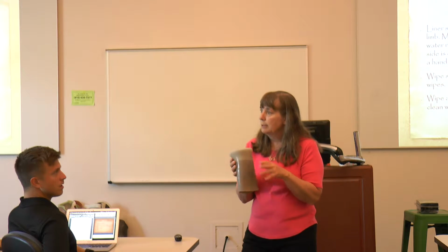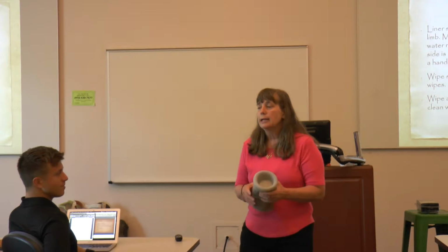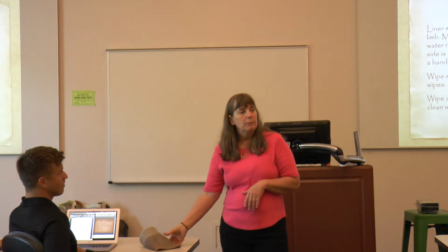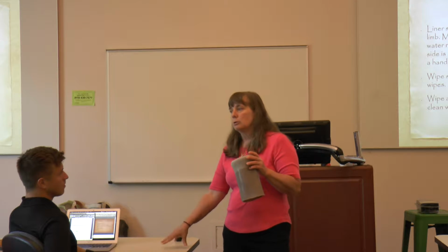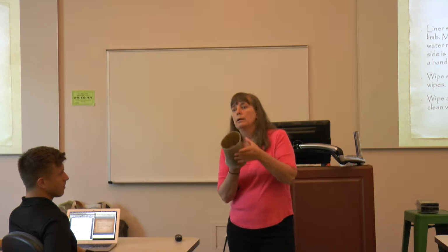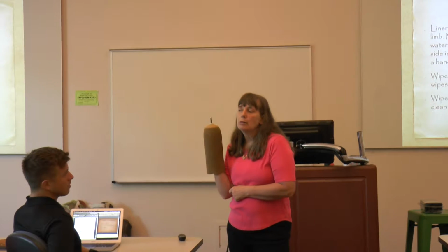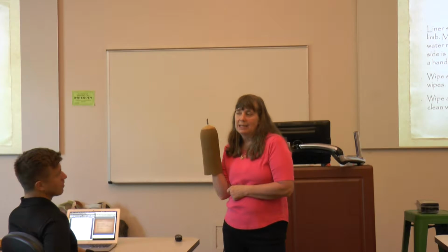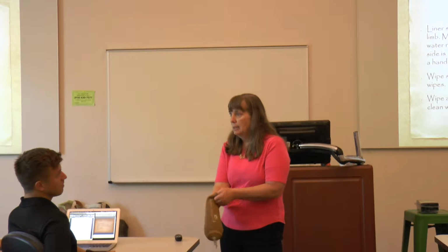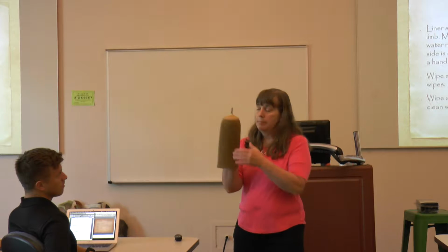If you leave soap on it, that can actually block the pores and cause some acne look on their leg. When they're done, they don't want to store it like this, because it is going to pick up every piece of dust, dirt, grime, okay? And so when they store it, they put it back like this on a stand. If they put it on an old wine bottle or something, make sure they take the label off, because the ink will absorb into the oil material, okay? So make sure it's on something that lets it get air up underneath it, okay?